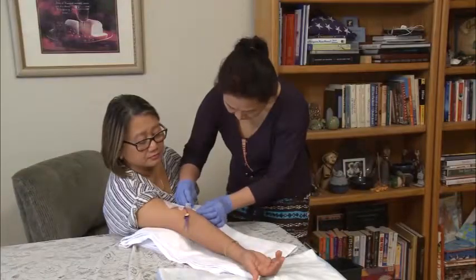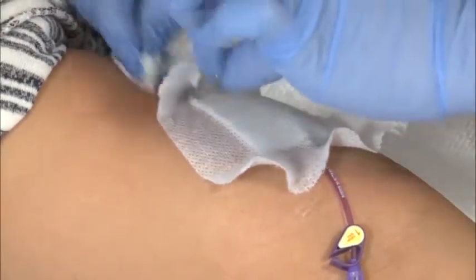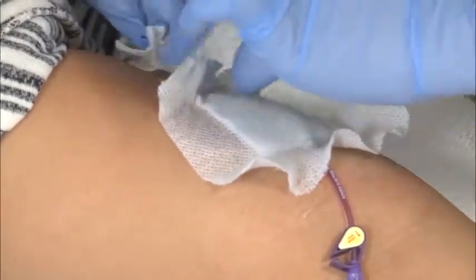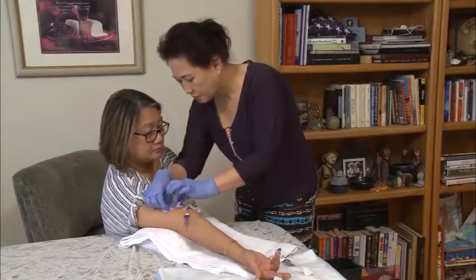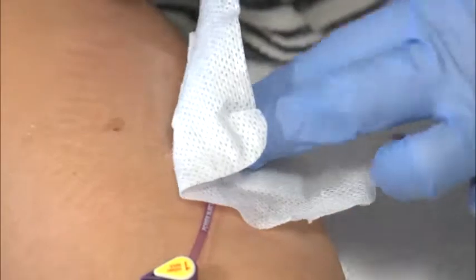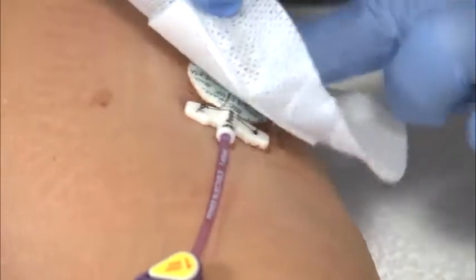Keep working around the outer edges. Use one hand to push the skin down and the other hand to pull up the dressing toward the center. This will keep you from pulling too much on the patient's skin. As you move to the hub and sutures, push down on them with 1 or 2 fingers to hold them in place while removing the bandage.